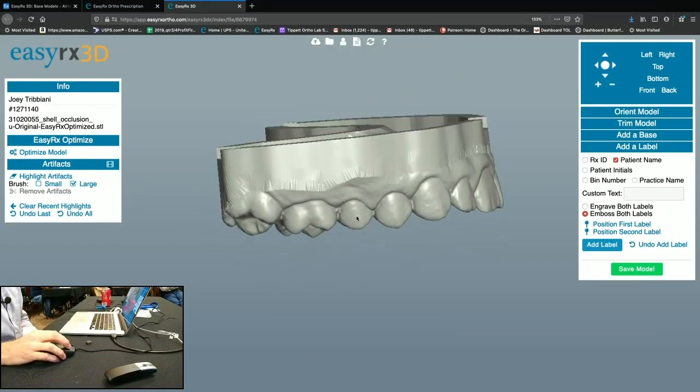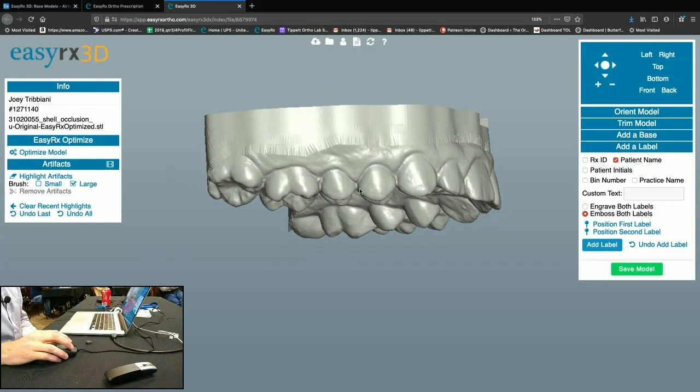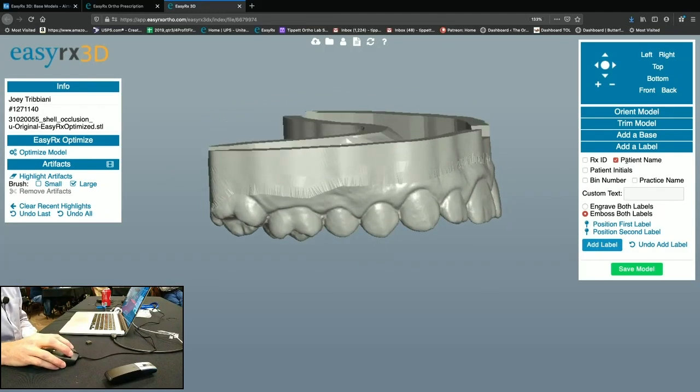So now, so that you know who it is when you pull it out of the printer, add a label. So there's RXID. It's pulling it all from over here. There's a name. The bin number was in the Rx. Whenever I checked it in, I assigned it a bin number. But we'll do patient name.